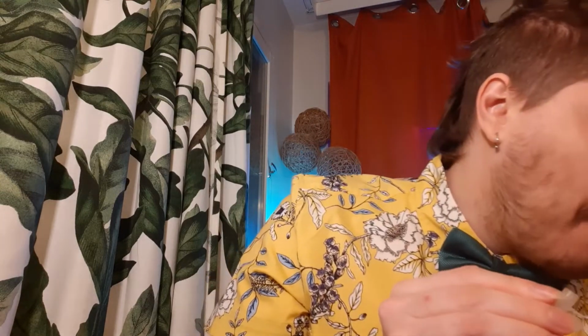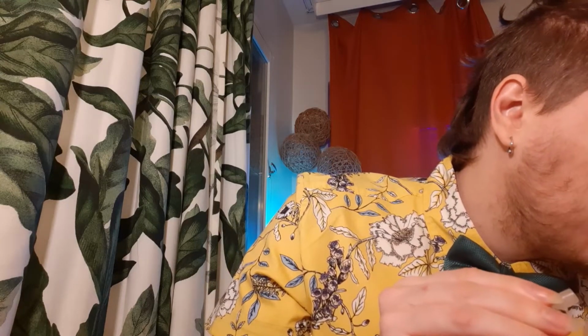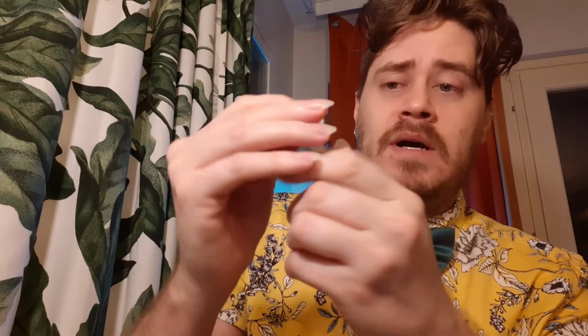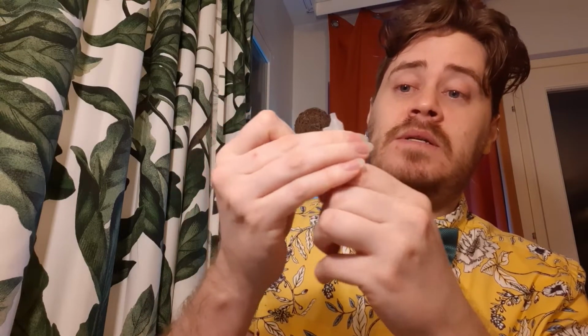I stick it right back in the thing because it is infectious, potentially. And we're going to cap it off because it says to cap it off. Oh, I see. And the tip is actually, it's got a hole in it so that you can eyedropper out just a couple of drops. That's pretty great. Okay, so it's snapped on, which is nice.